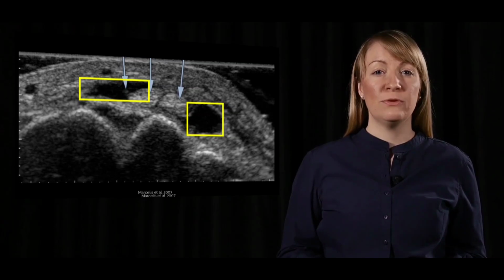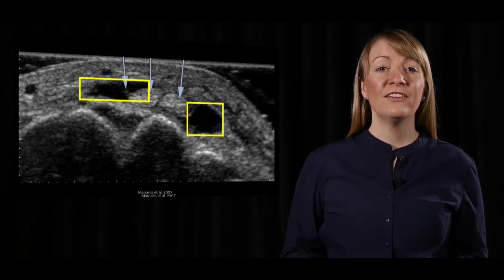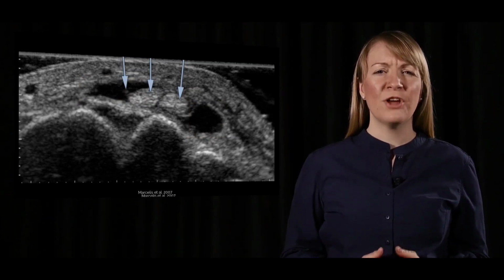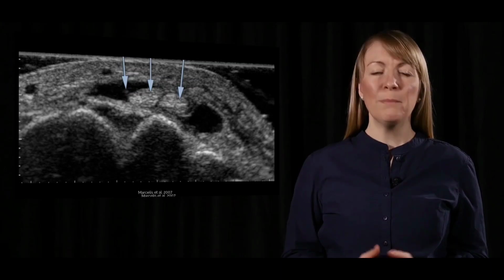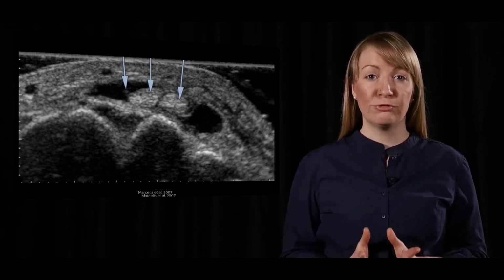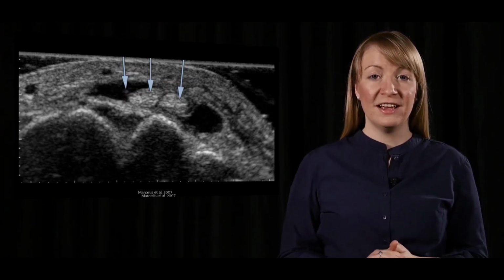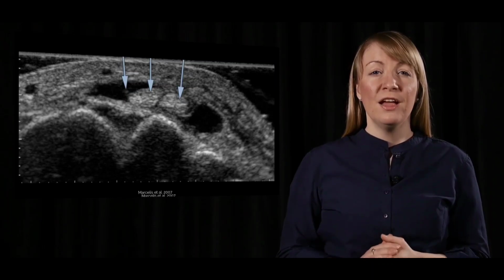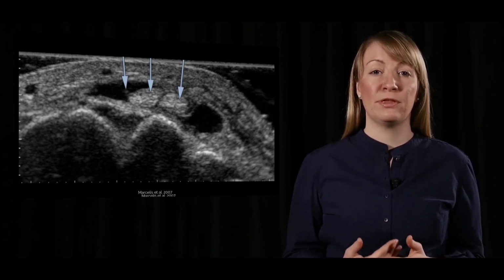The echogenicity within the tendon sheath, indicated by the yellow box, has turned anechoic. There seems to be no problem in fibre continuity. Based on this static image, it can't be confirmed whether there is a functional problem. We can assume, based on previous findings, that this patient shows a tenosynovitis. This patient should be scanned in the other plane as well to double-check the pathology.